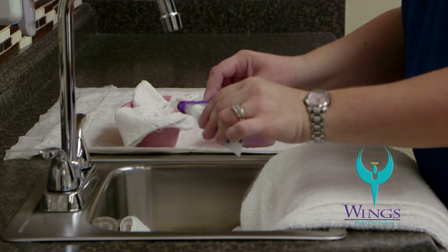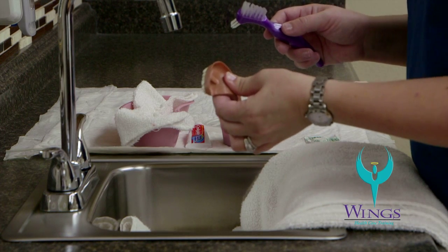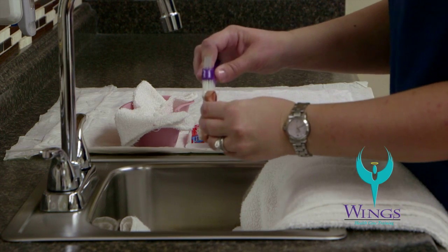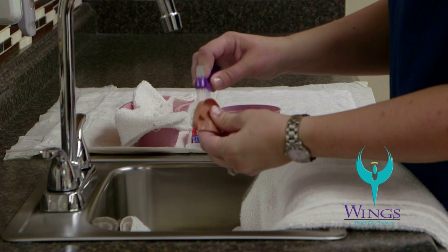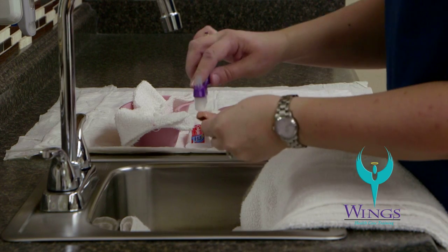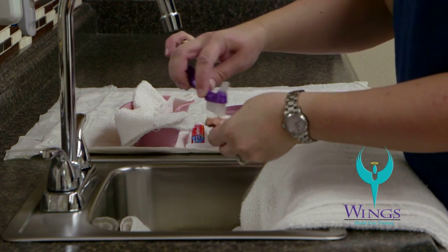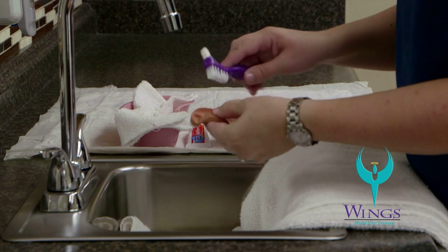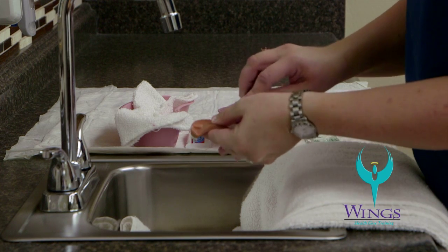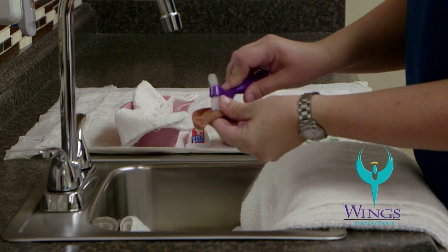If needed, apply a small amount more of toothpaste and get the top plate of the denture. Start cleaning the outside surfaces of the denture and the roof of the mouth, making sure to clean all chewing surfaces. Then turn the denture over to clean the inside, making sure to clean all the grooves in the top piece of the denture.